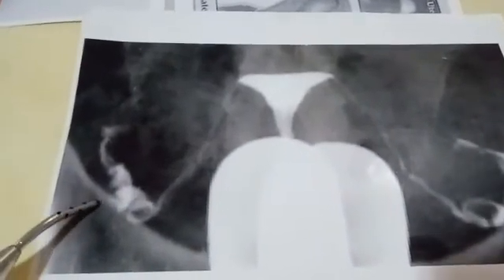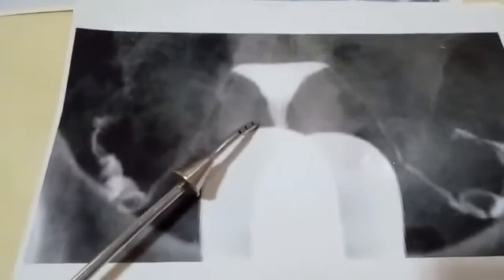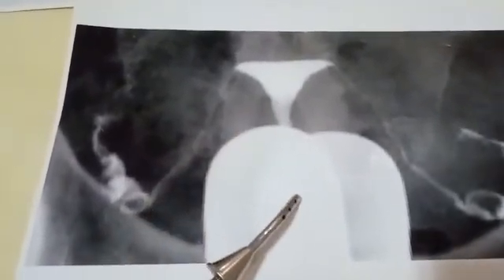This hysterosalpingography shows a normal uterine cavity with patent fallopian tubes. We can see the dye exiting — this is called the peritoneal spill, confirming tubal patency. The uterine cavity is normal, tubes are patent, and peritoneal spill is present. You can also see the Cusco speculum in the image.